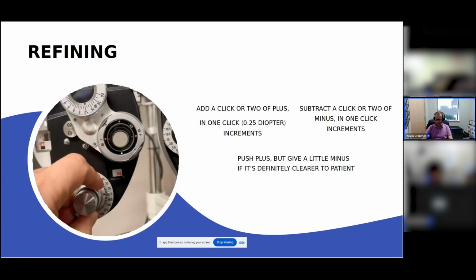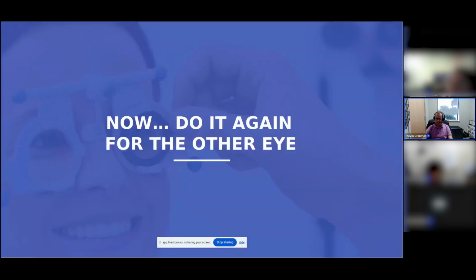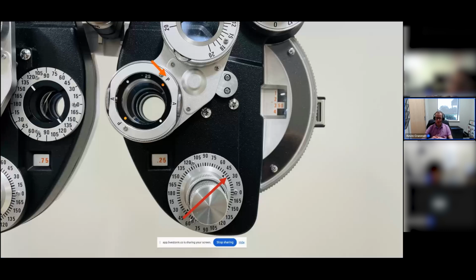Okay, so now if we flip back and forth, let's say the patient says this one is better. So now we're going to use the other knob on the astigmatism correction at the bottom where that red arrow is. You're going to use the knob that's closer to you, in the center.